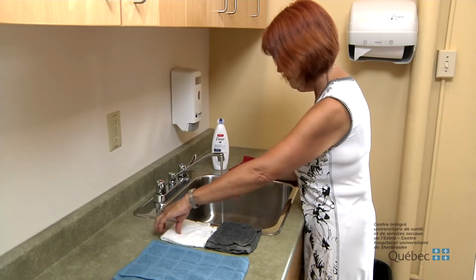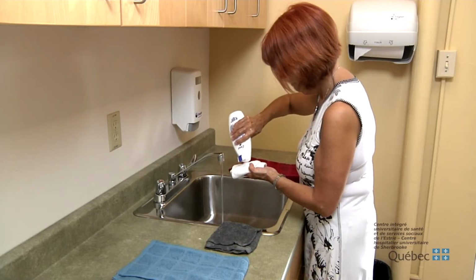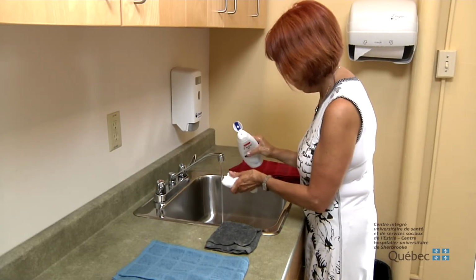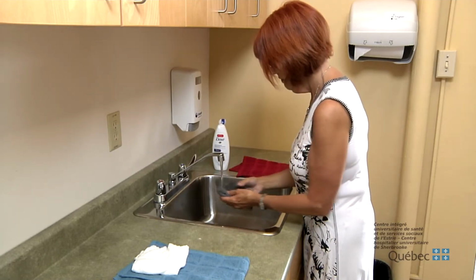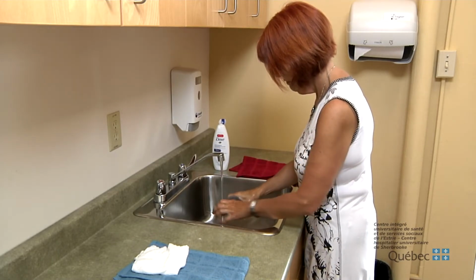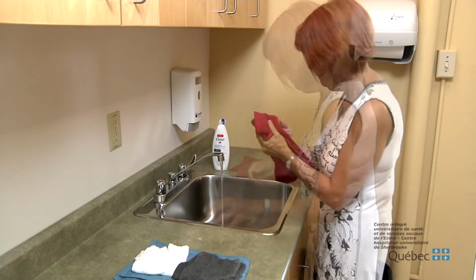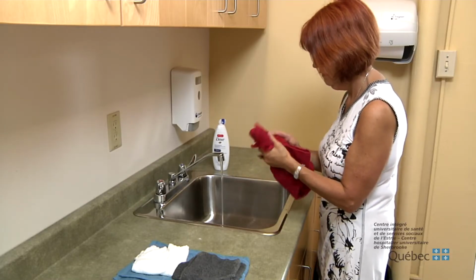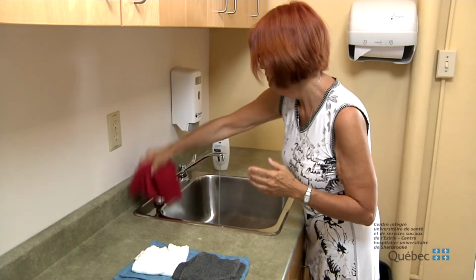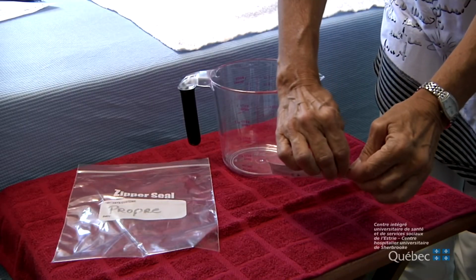Moisten a washcloth with tap water. Apply some soap and lay the washcloth on the end towel. Moisten the second washcloth with tap water and place it next to the first washcloth. Dry your hands on the unused hand towel and use it to turn the faucet off. Open the lubricant.